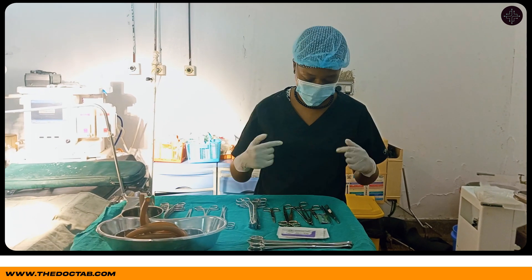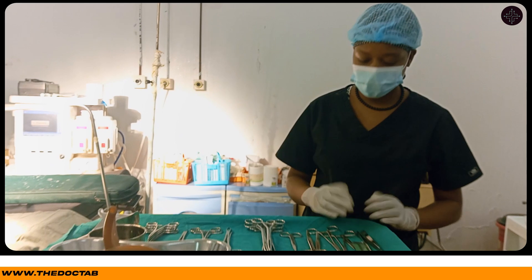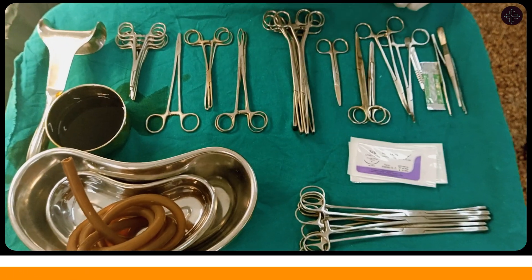Hi guys, so this is Beto Tieno. Welcome to my simple seerset. You can have a look before I show you.